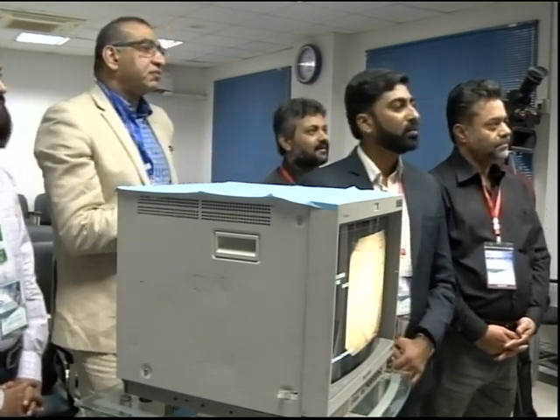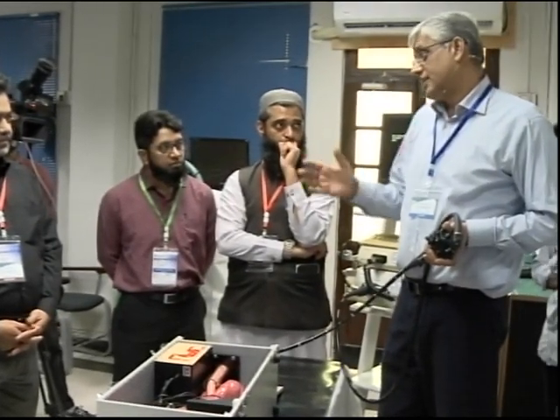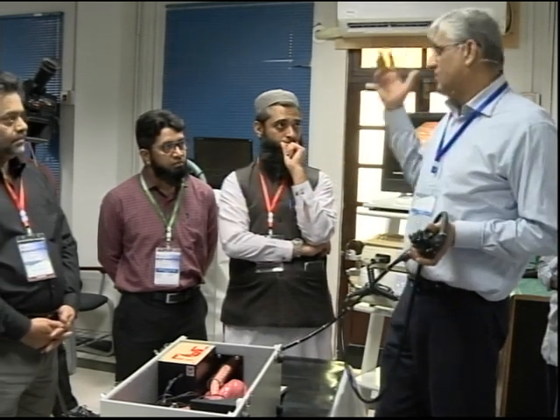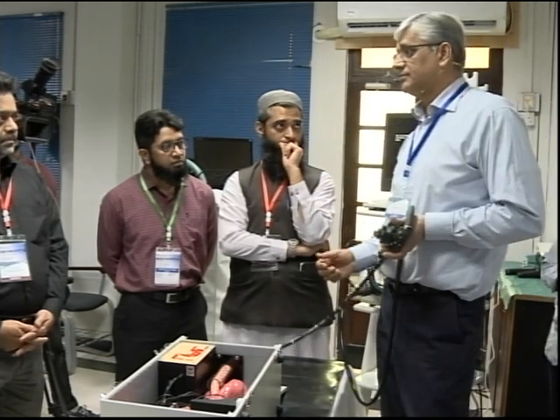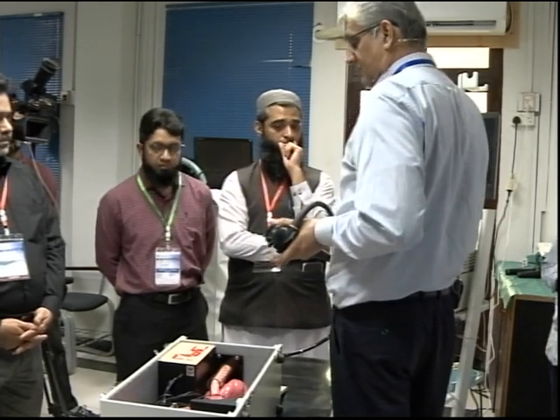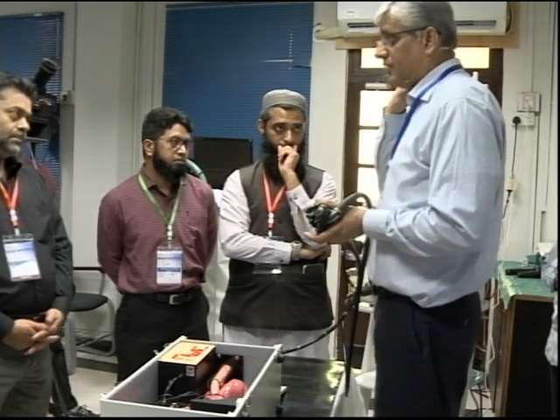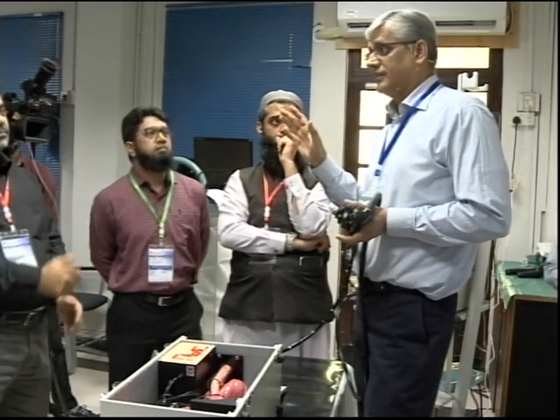I think it's very important to have more than one screen, it's very useful, but I'll tell you, in all my private cases I only have one screen. No, in fact, that's not fair, I have two screens, so I usually look at the one that's in front. But sometimes, in certain cases where your position is such that it's much more comfortable to look this side, you look there. You have to remember, you're young people and you have to look after your back and neck. I've destroyed mine too late.